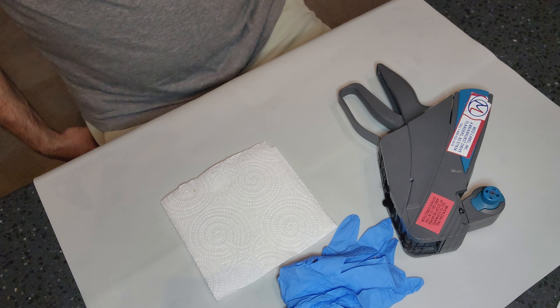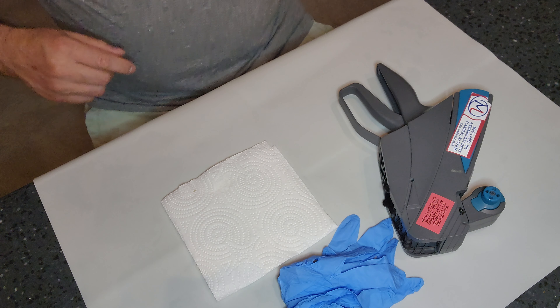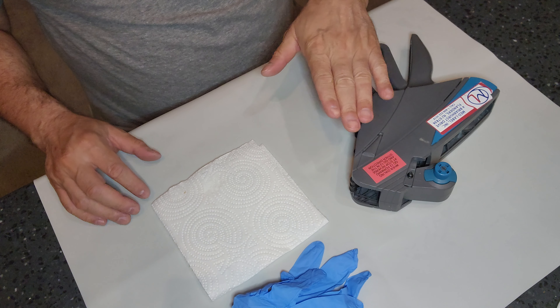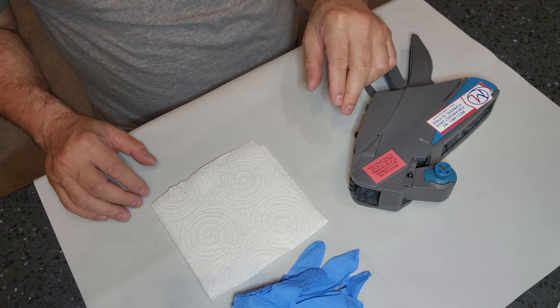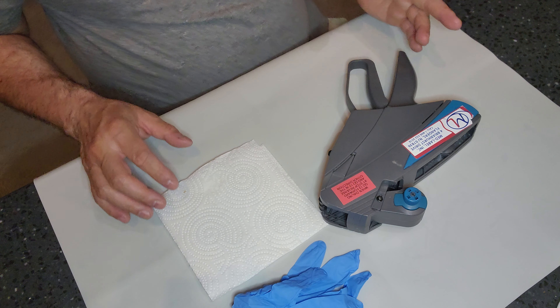What's going on guys, welcome back to WDYDCSP — What Do You Do as a Central Sterile Processor. Today I'm going to show you how to change out the ink on your lot sticker gun. This can be really messy if you've never done it before, but I'm going to show you how to do this in a less messy way.